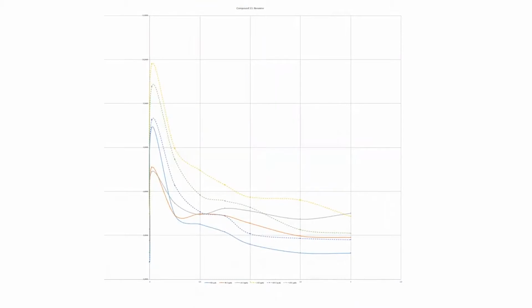We see concentration to time curves of benzene in exhaled air. We can see that both the peak height immediately after the smoking event and decay rate by time were different for each person. Other aromatic compounds like toluene, xylene, styrene, ethylbenzene had similar patterns of curves. Note that in this and the next figures, the solid lines belong to persons with chronic obstructive pulmonary disease.